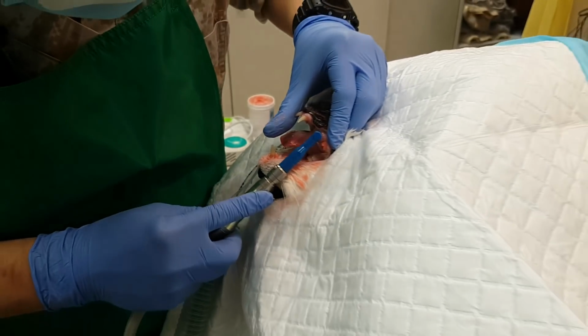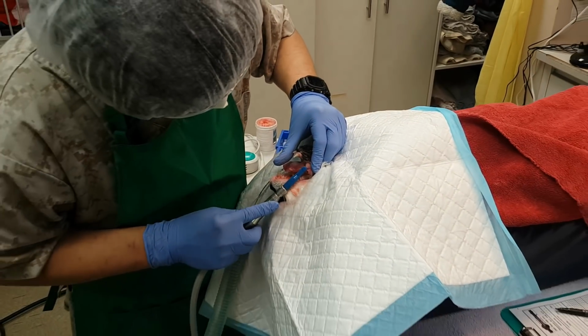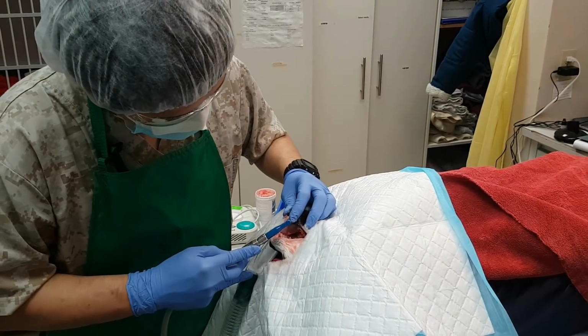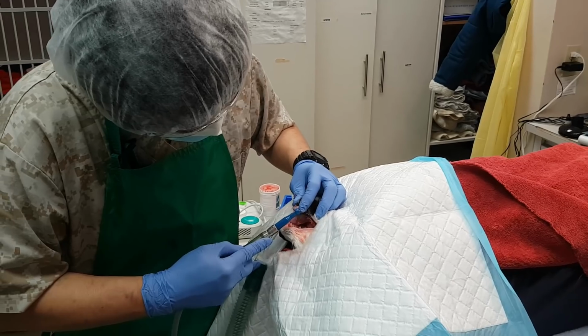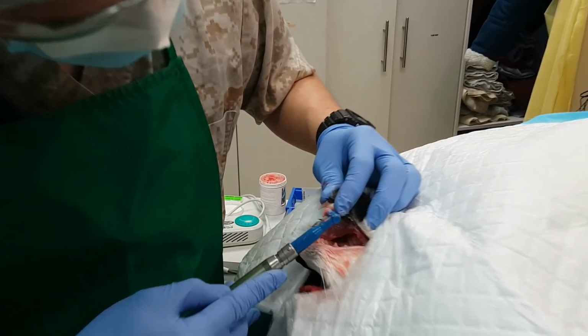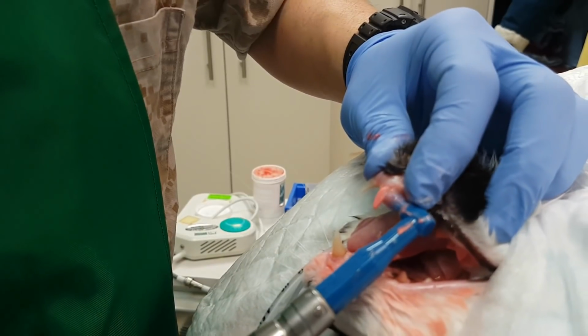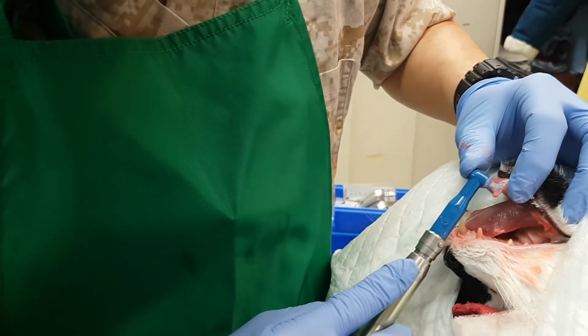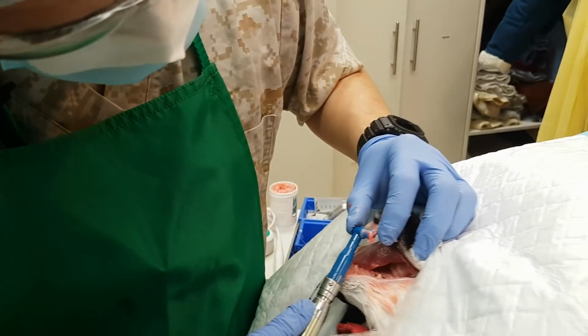The importance of proper anesthetic monitoring cannot possibly be overstated. The reason I'm very comfortable doing complex anesthesia in very compromised patients is because I have a team that I can rely on. The gold standard is doing measurements every 5 minutes, which include full vitals as well as recording any monitoring equipment you have.